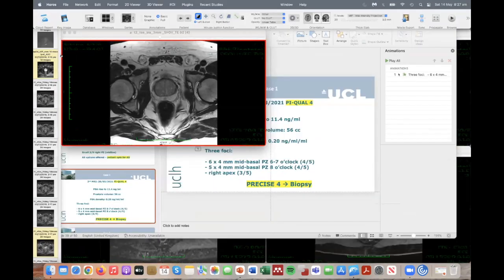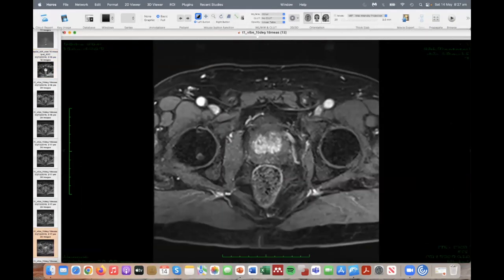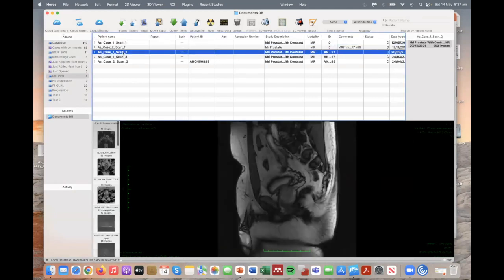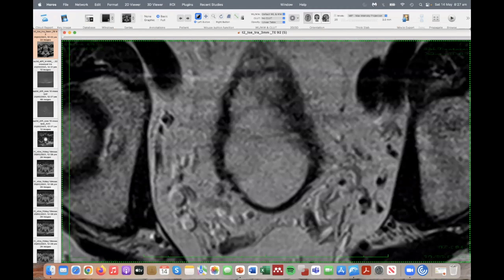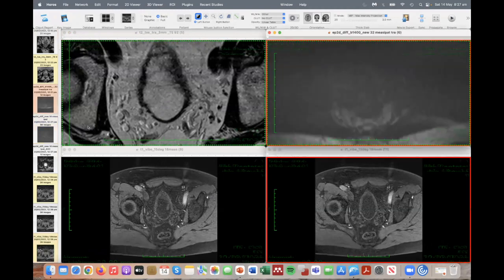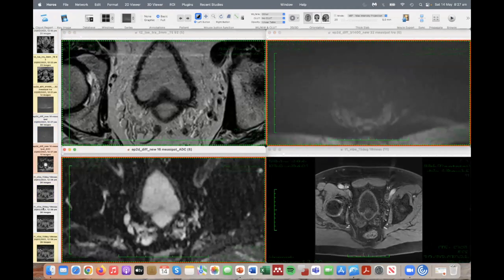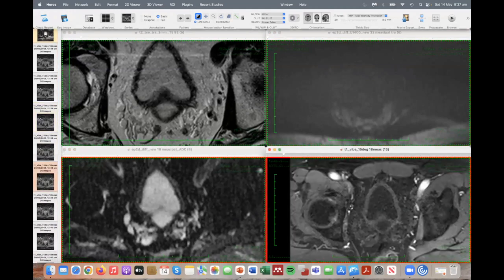Just while you're getting that up, Francesco, Veeru, in terms of the biopsy that was done, can you just perhaps for the urologists in the audience, how would you have done that? Yeah, so all of the biopsies now at UCLH are transperineal, typically either with sedation or under local anesthetic, the majority probably under sedation.